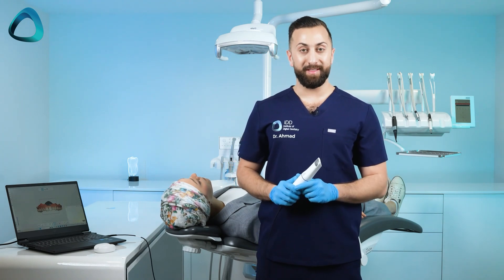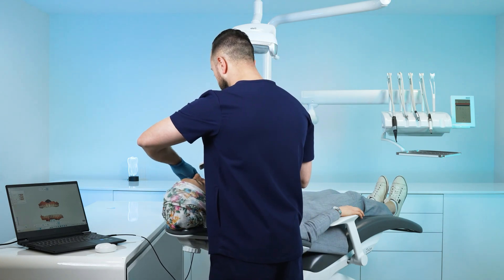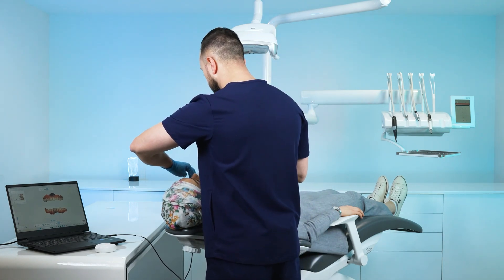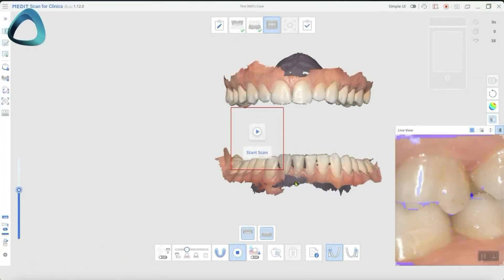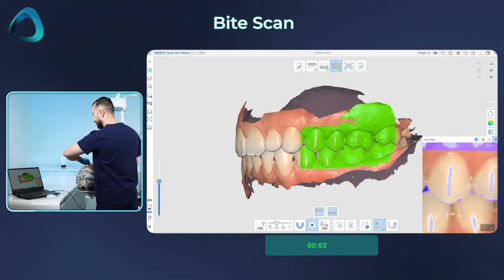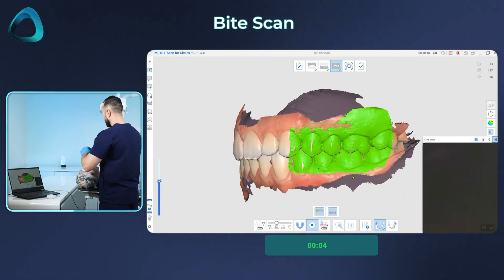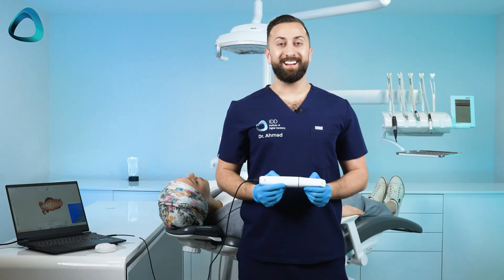So now let's scan the bite. We get the patient to bite down and move the scanner into the mouth. Before you start the scanning process, you want to be in the right position — which is usually the scanner facing the occlusal table at a 90-degree angle — and then you start the scanning process by double-clicking on the touch band. Then you move the scanner from a distal to mesial position while capturing the bite. And that is full arch scanning with the Meta i900.